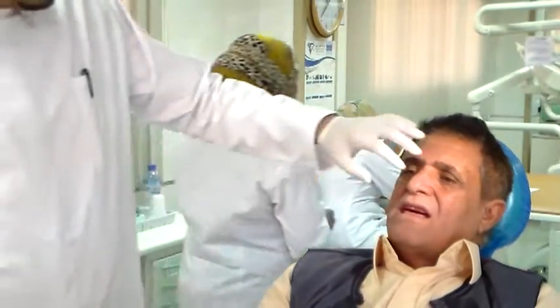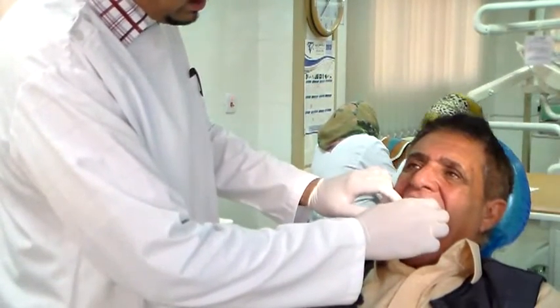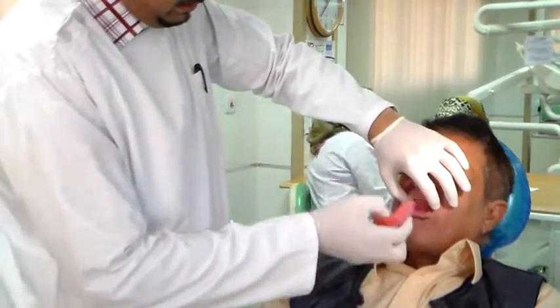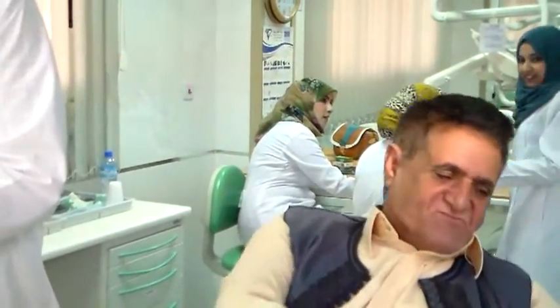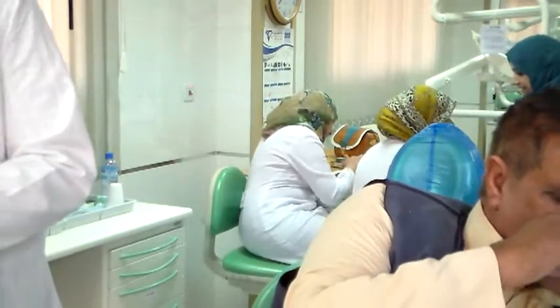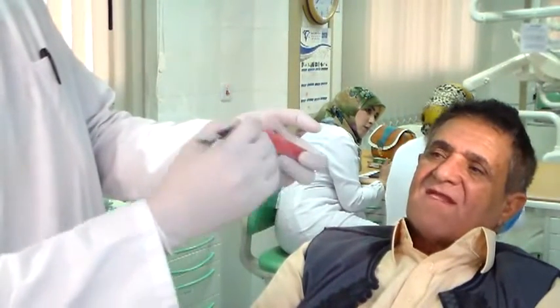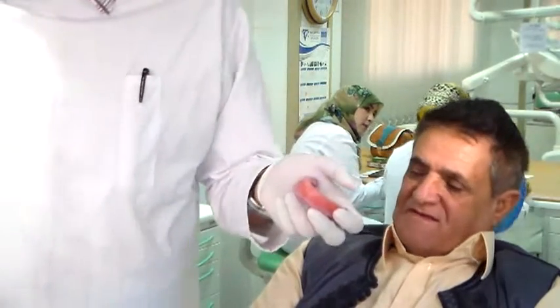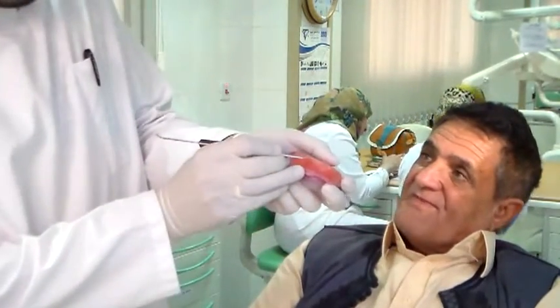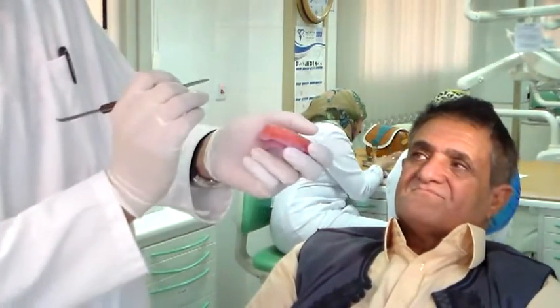So I want to mark this. Take out the lower rim. Take out both the rims. Higher than this, because this is touching, and you know that you want to reduce it about 6 millimeters. So you want to reduce from the point of contact 6 millimeters. 6 millimeters from this point of contact will be something like this. So you reduce this much out, and then we see how it goes.